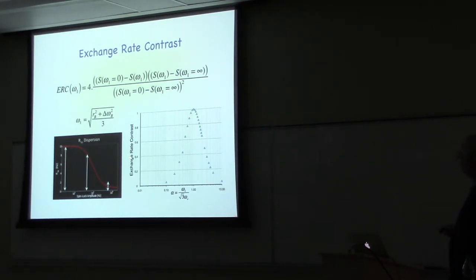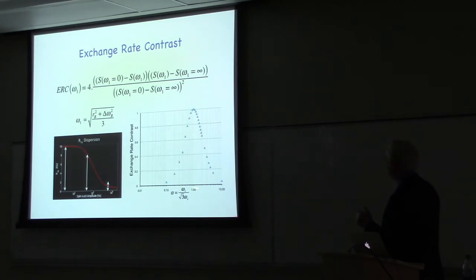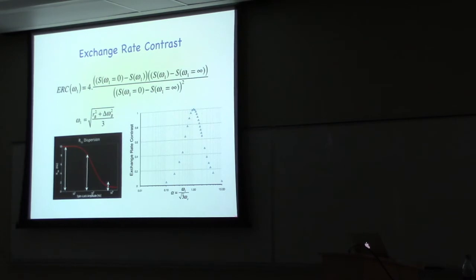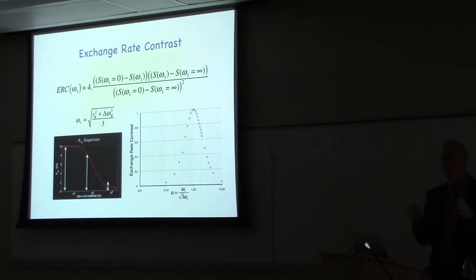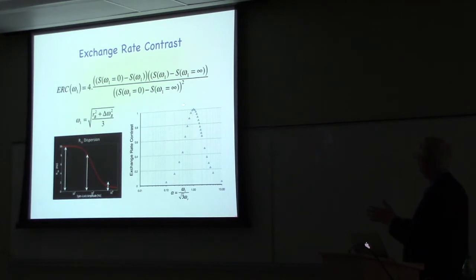And what this curve says is this is the signal contrast in the resulting image according to how the exchange rate relates to this number. So if you're at this exchange rate, then you get a big signal. But if your exchange rate is much different, you don't contribute much at all. So you can think of all these protons in a tissue in multiple different environments, and think of there'll be one group whose exchange rate is, say, 500 Hertz. So by choosing the right frequency here and doing this manipulation, you can get all the spins which have an exchange rate of 500, and maybe those including, say, 300 and 600, but things that exchange very rapidly or very slowly won't contribute. That was the theory.